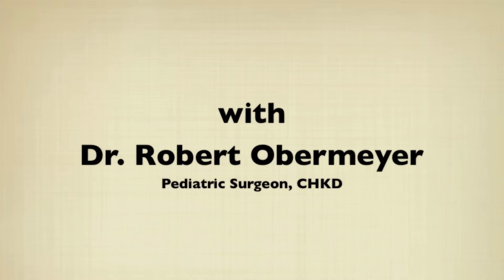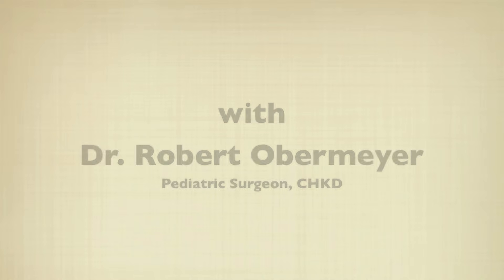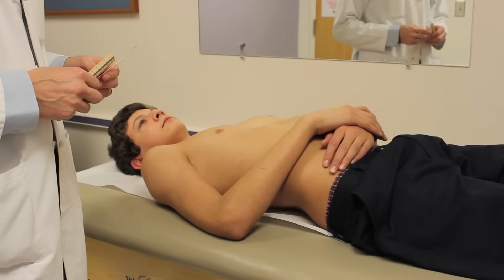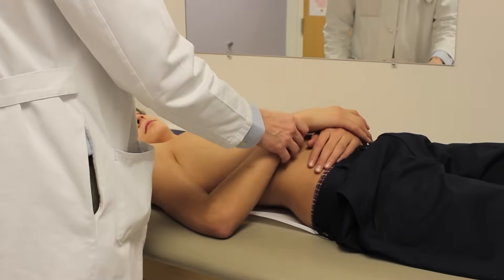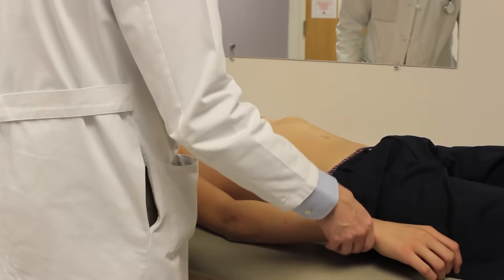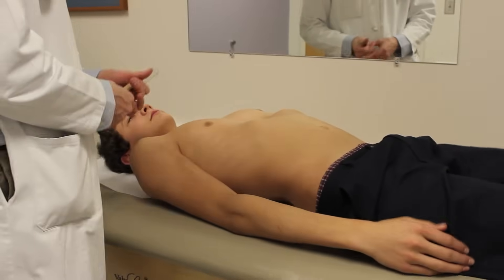Knowing that you are not interested in surgery, I'll get some measurements of your chest. We want to make sure that we get our measurements with the arms by the side, so that we get consistent measurements.